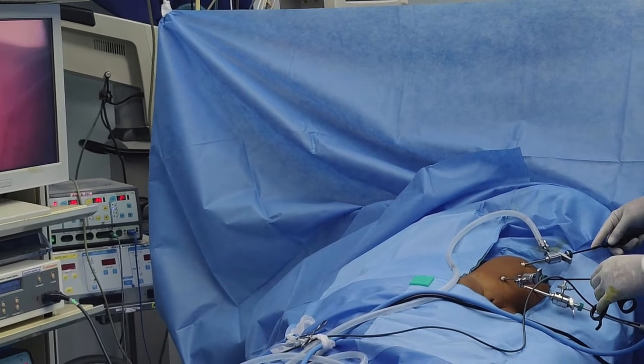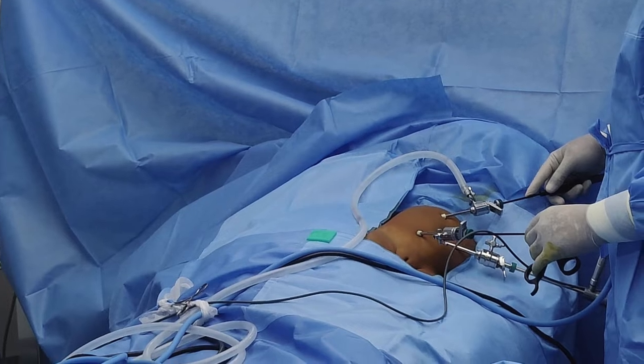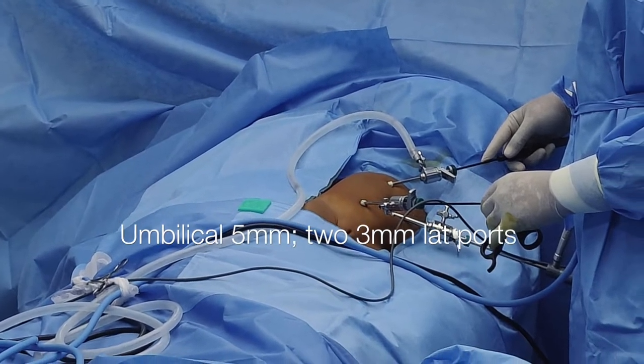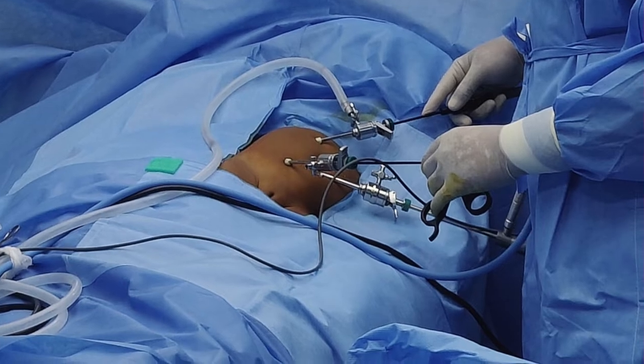Here is the position of the patient and laparoscopy is being done. A 5mm umbilical port and two 3mm lateral ports have been inserted. The table has been kept as low as possible to keep it ergonomically comfortable.